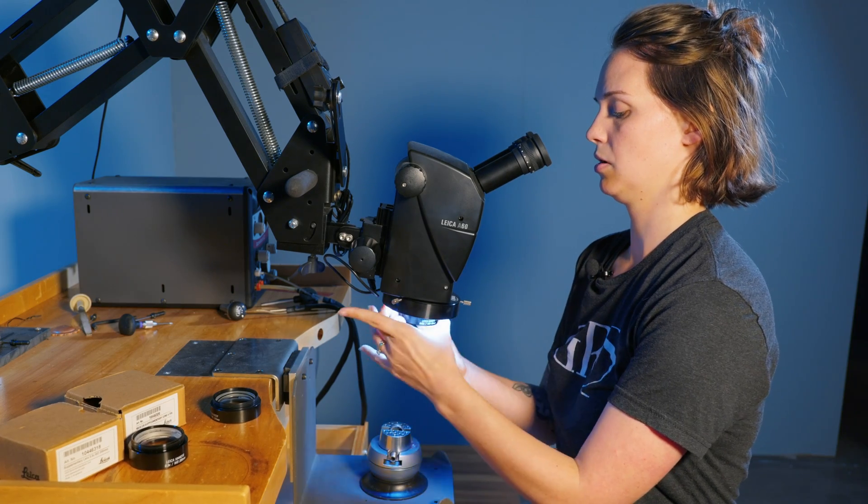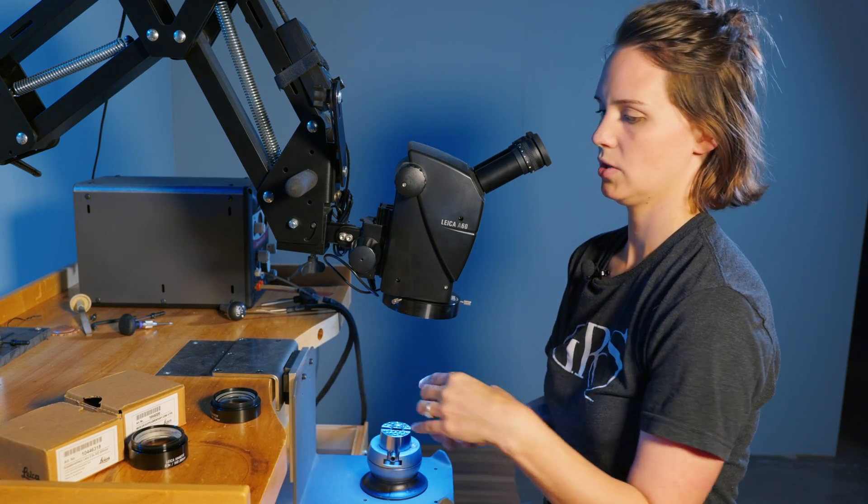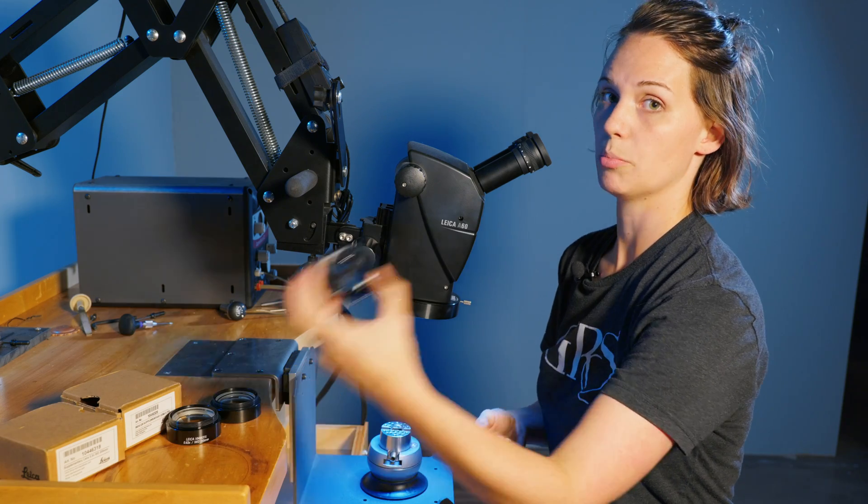If you need an even larger field diameter or you have large tools that you need to get under your microscope, you can bump up to the next option which is the 0.5 lens. This is going to jump us up to almost eight inches for a working distance.